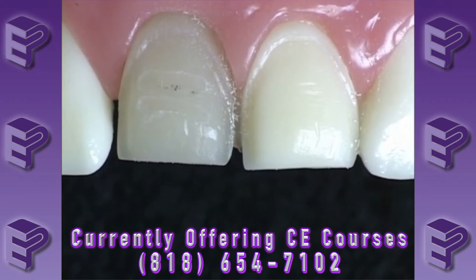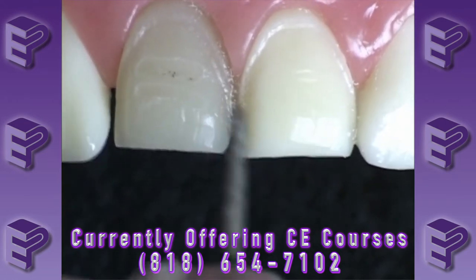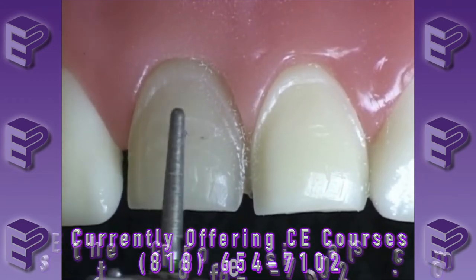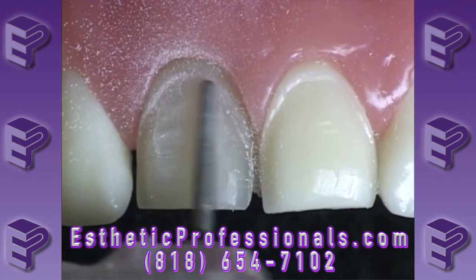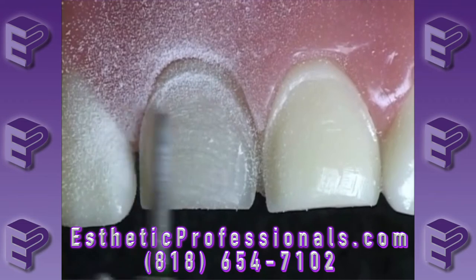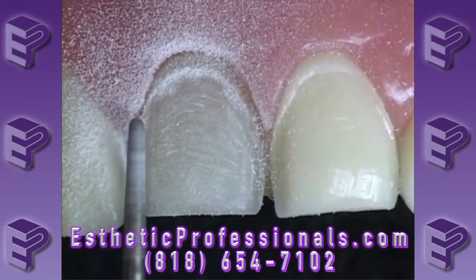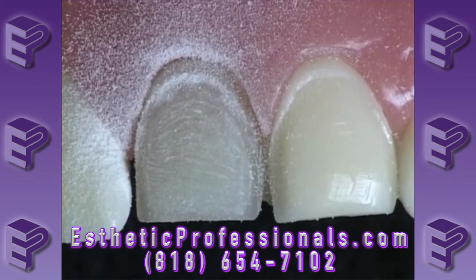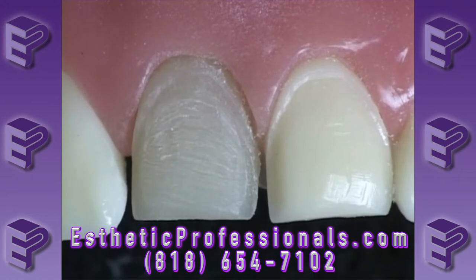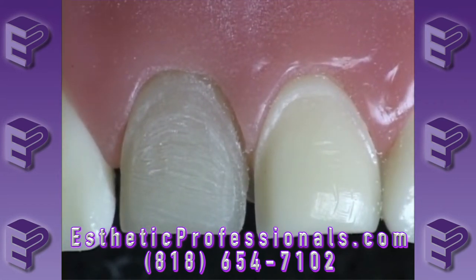Now we can go ahead and take our chamfer diamond and prepare the entire facial surface of the veneer. It's important when we prepare the facial surface that you stay away from the margins, because we want to make sure we still have a nice positive seat with our margins. You can see it's not very deep. We generally always have a little bit of space from the dye spacer during the veneer fabrication, and we're just giving it a little bit of extra space. We don't need a ton of space for this technique, but we do need a little bit of additional space to what we receive from the laboratory.